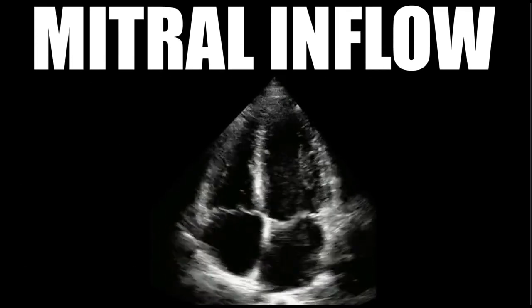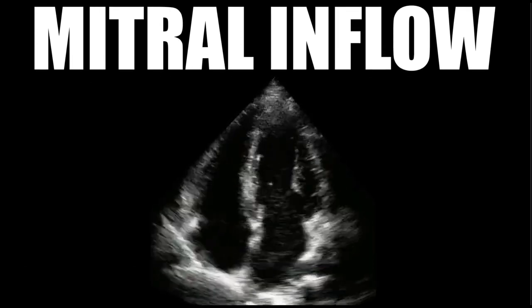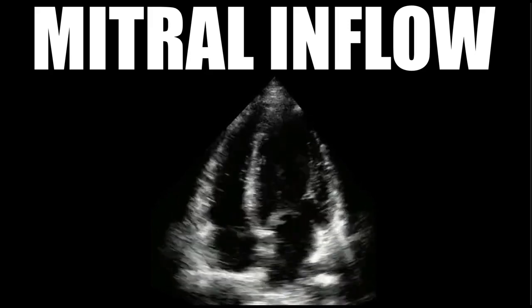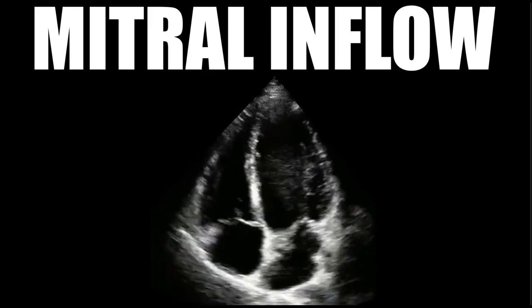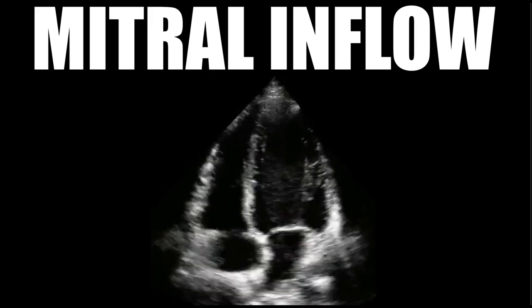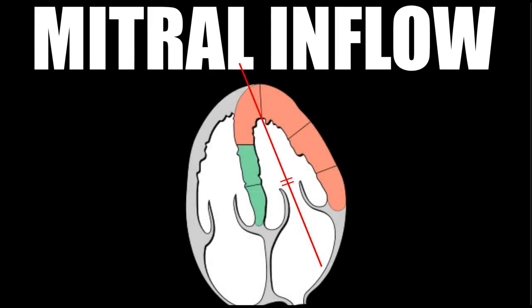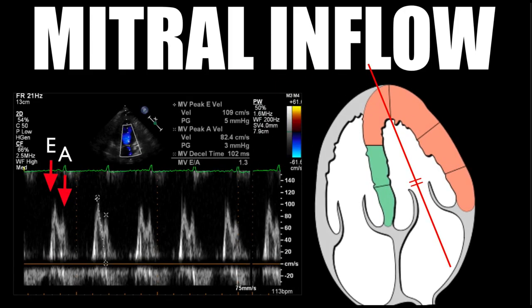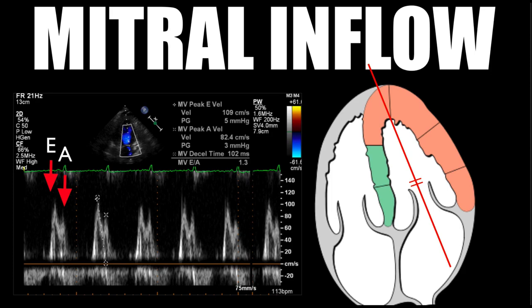You're going to want to get an apical four-chamber view of the heart, with a nice view of the mitral valve, making sure that you can see the entire left atrium. You'll want to place the pulsed wave Doppler gate right at the tips of the mitral valve leaflets, just when they're open — right there at the tips. Once you hit pulsed wave Doppler, it's going to give you these velocities, which represent blood flow as it moves into the left ventricle.